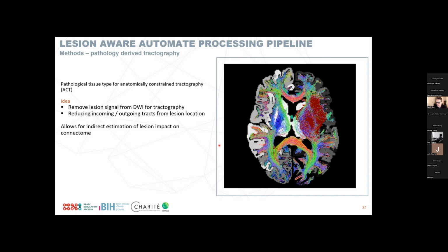As I mentioned, the diffusion-weighted imaging, but we have this probability for each of those voxels. If we come from behind and we go through, or we come from the left, basically in 3D space, what is the probability? And it just creates millions of tracks randomly and then selects those that fulfill this criteria of not going through CSF, etc.